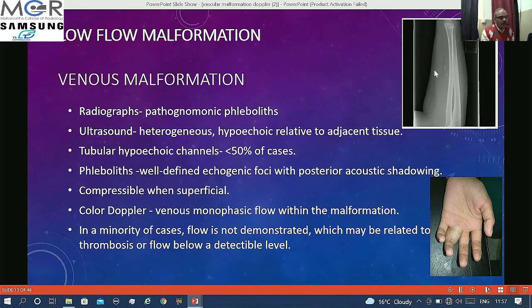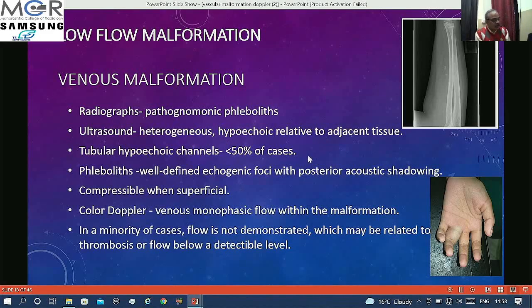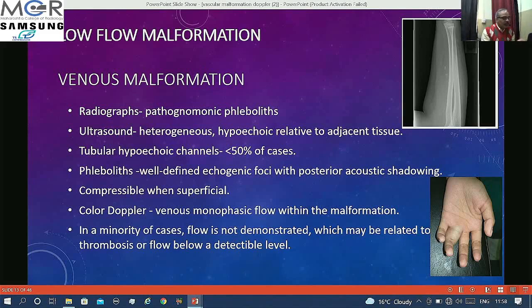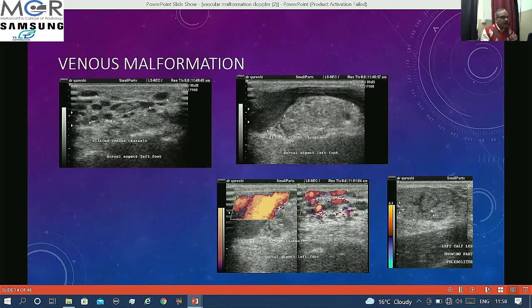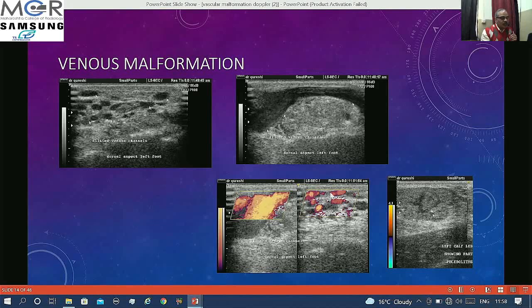Venous malformation: if phleboliths are found on X-ray it is pathognomonic. On ultrasound, they appear as hypoechoic or anechoic tubular channels. Phleboliths can be seen on ultrasound as small echogenic foci like calculi, possibly with posterior acoustic shadowing — smaller ones may not show shadowing. They are compressible when superficial, and Doppler shows monophasic flow. Sometimes flow may not be demonstrated, but fine movements in the internal echo indicate flow slower than detectable by Doppler, yet the diagnosis can still be made. An example shows multiple anechoic tubular channels with a large draining channel showing venous type flow.